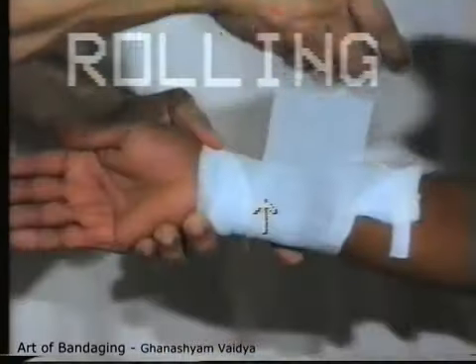Rolling the bandage. Now roll the bandage to cover the entire dressing. Apply the bandage from below upwards, from within outwards, and with uniform pressure. That is, when the bandage comes in front of the limb, it should pass from within outwards. The bandage must be applied with uniform pressure, neither too tight nor too loose, and with equal pressure in each turn.